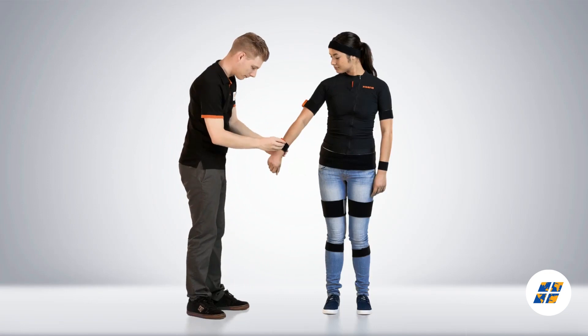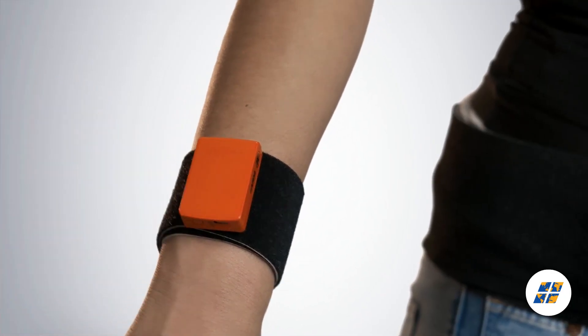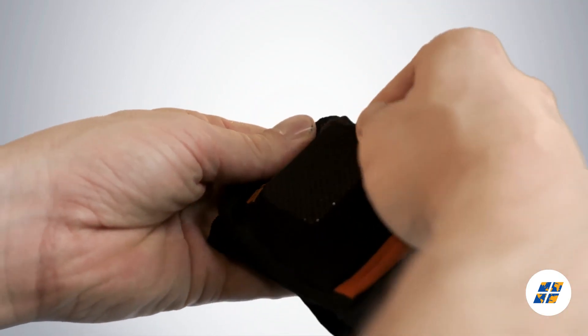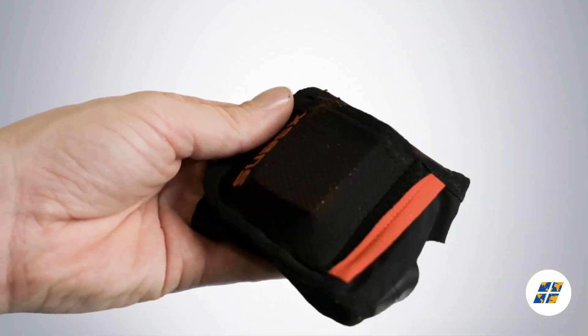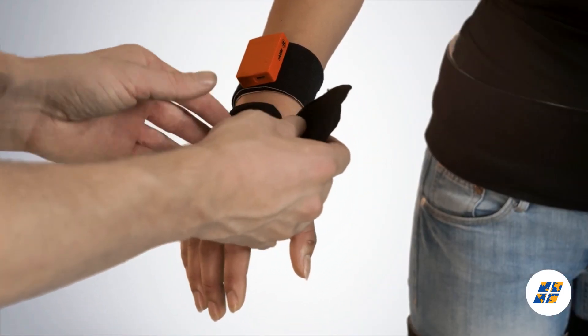The lower arm motion tracker needs to be placed on top, just above the wrist. Place the hand motion tracker in the glove and put it on. Repeat the same process for the opposite arm.